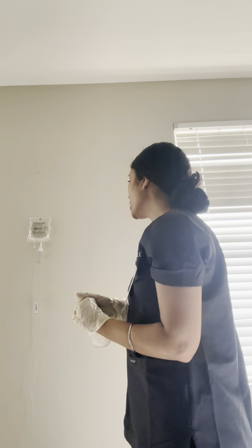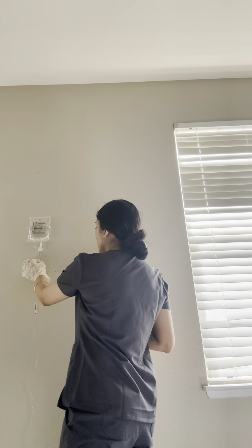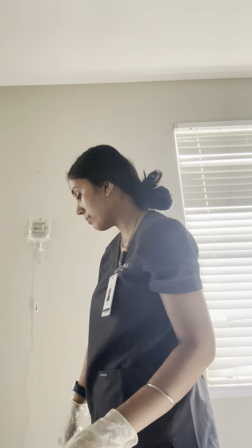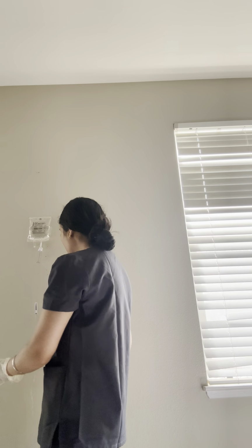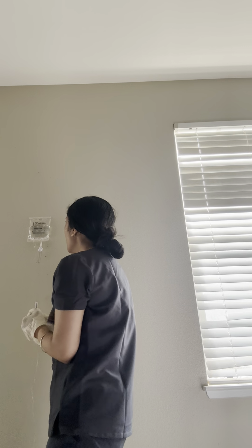Okay, so once that is hung 30 inches above the patient's IV, we want to make sure that the drip chamber has fluid in there halfway. We want to inspect the tubing to make sure that there is no air bubbles or kinks, and if there are, you would make sure that you get those air bubbles out. And then the next step is to confirm the accuracy of our calculations.